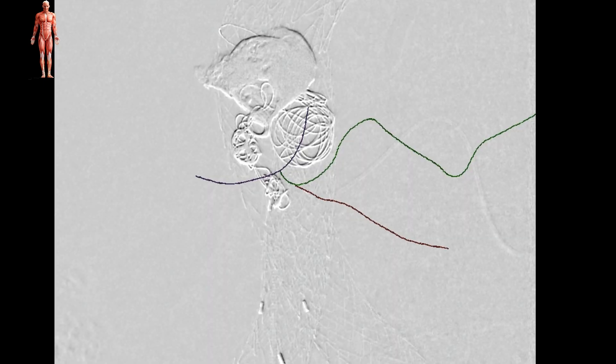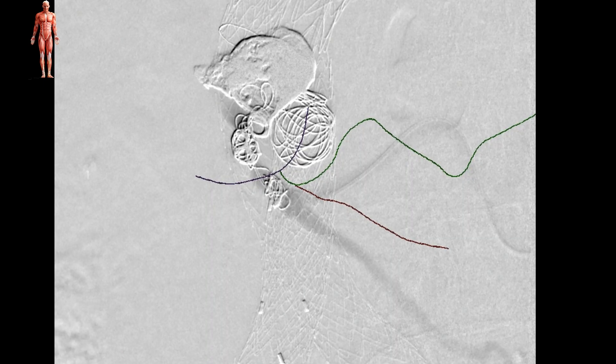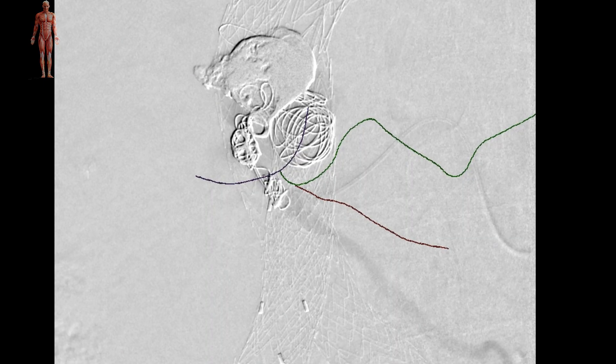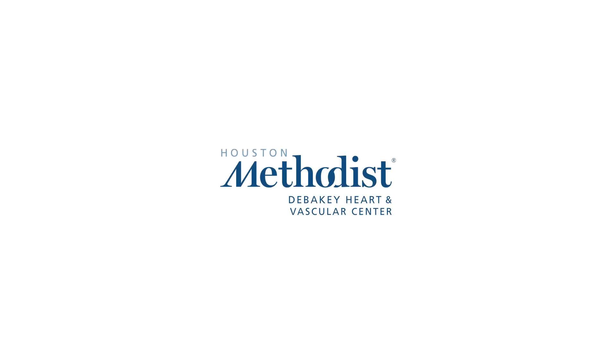At this point, we completed our procedure and removed all endovascular devices.